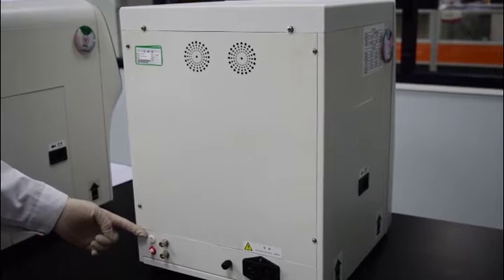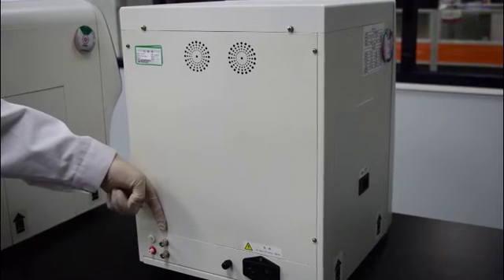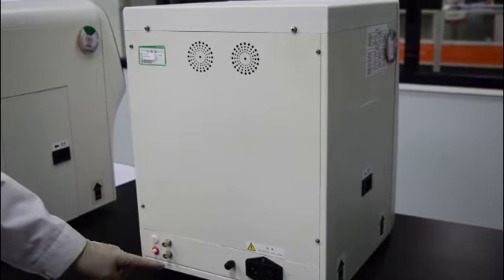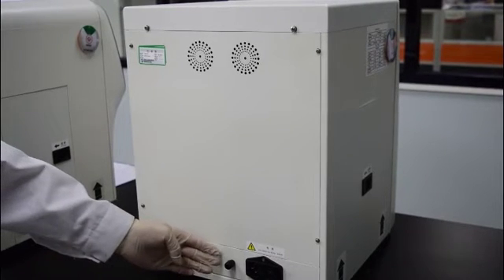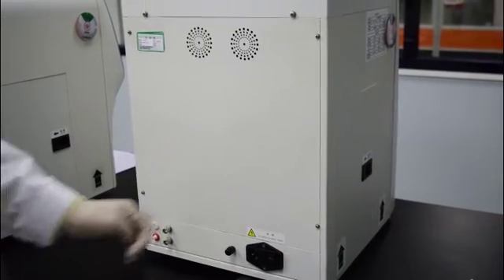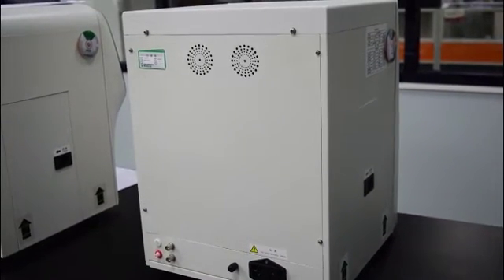On the rear panel, there are the diluent tube connector, diluent sensor cable connector, waste tube connector, waste sensor cable connector, ground line connector, power cable connector, and power switch. Up there are two fan vents.